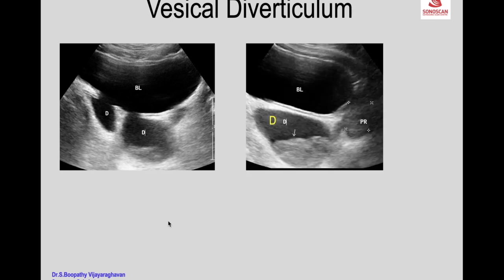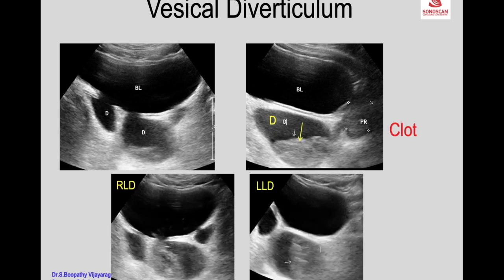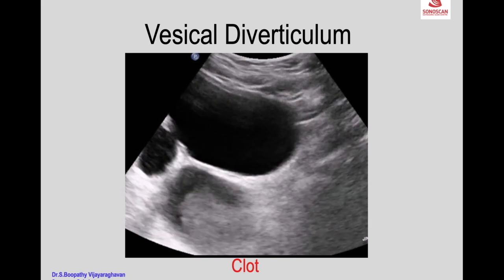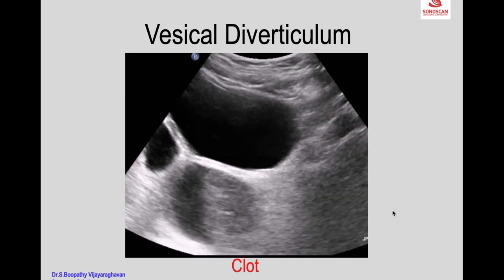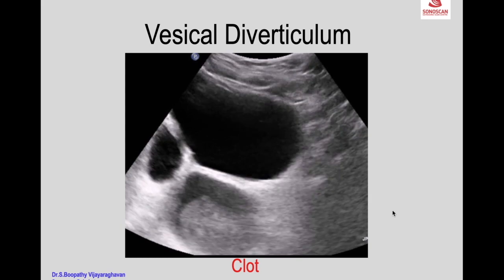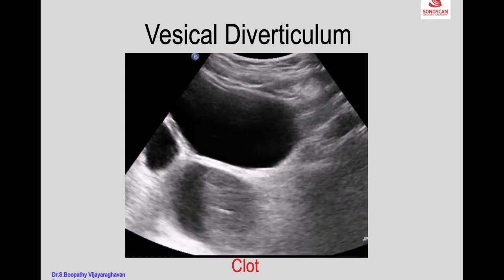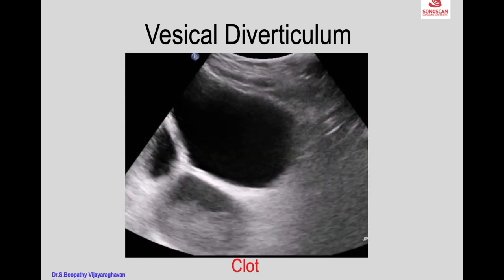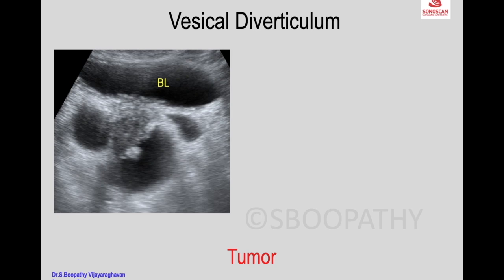Soft tissue mass within the diverticulum due to a clot can be seen in patients presenting with hematuria. The clot can be confirmed by shifting the position of the patient — the clot shifts within the diverticulum. Color Doppler shows no flow, confirming it is a clot. The shifting clot with patient repositioning is nicely demonstrated.